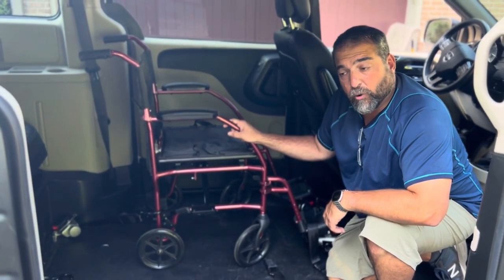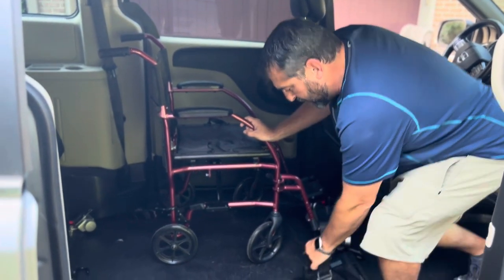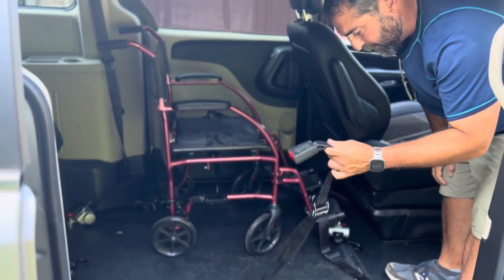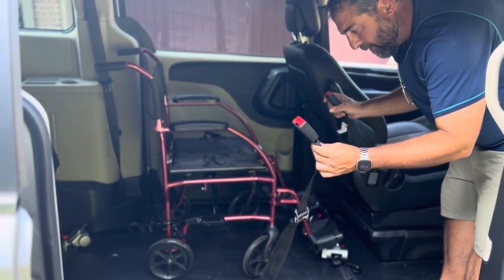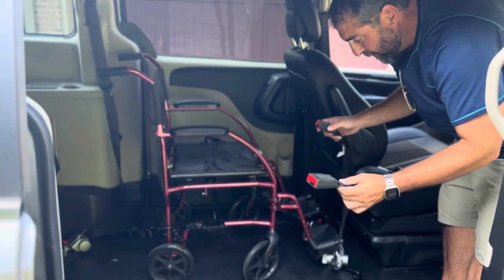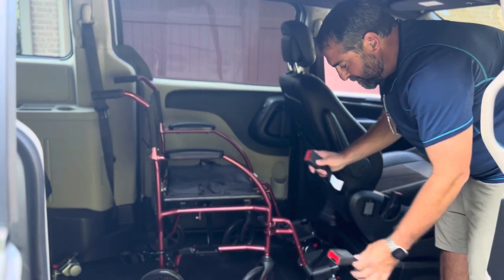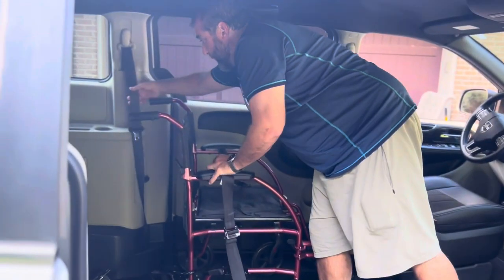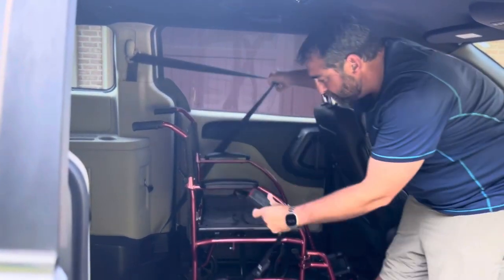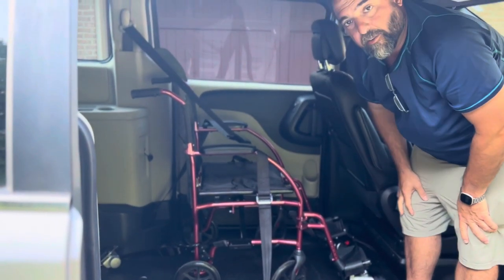Step four is to put the seat belt on the person. Note that there are two seat belt buckles in here. When you have two wheelchair passengers, make sure the rear passenger uses the rear buckle and the front passenger uses the front buckle. Here's the seat belt for this passenger — it comes across them like so, and they're all set and ready to go.